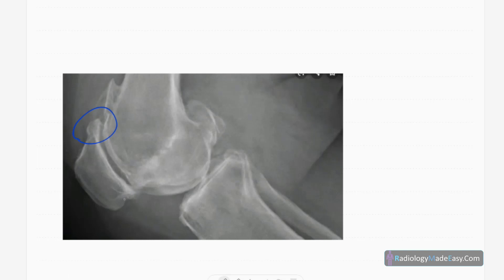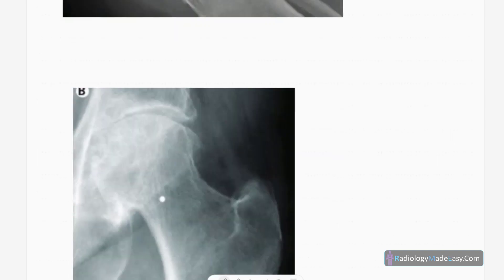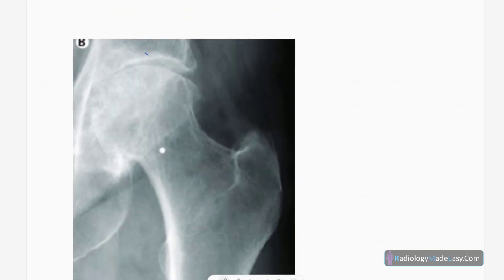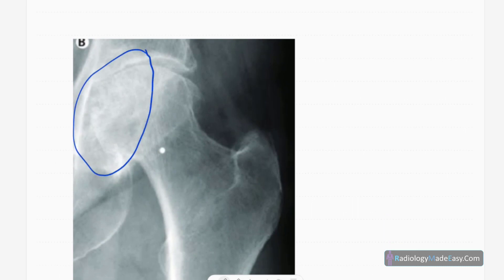This is the hip joint. There is joint space narrowing in the hip joint along with a few osteophyte formations and subchondral sclerosis. This is another example of osteoarthritis. Importantly, there are no erosions — that is another key differentiating feature.